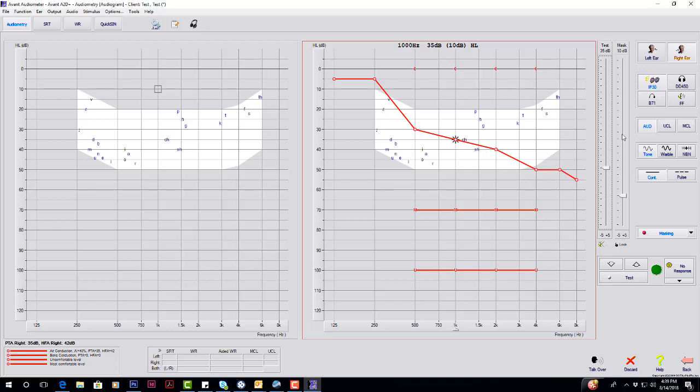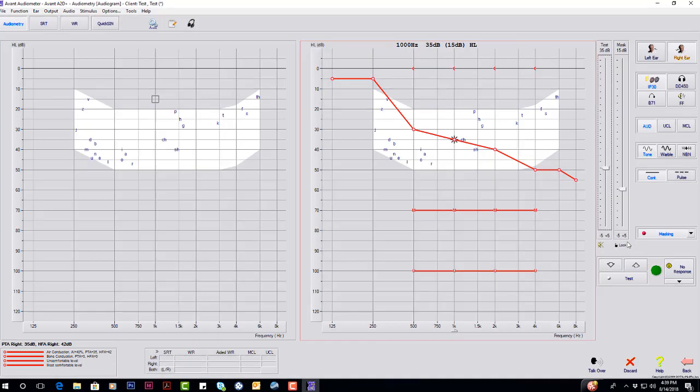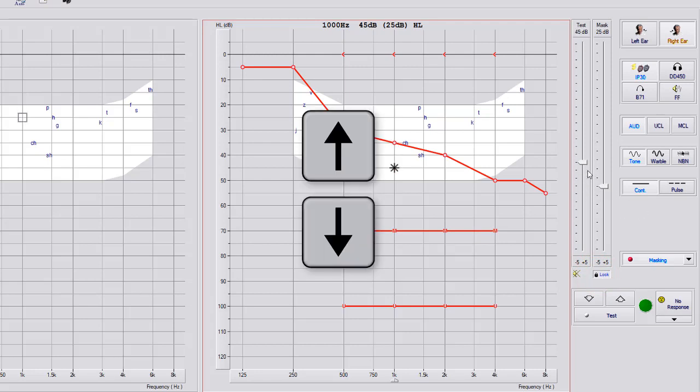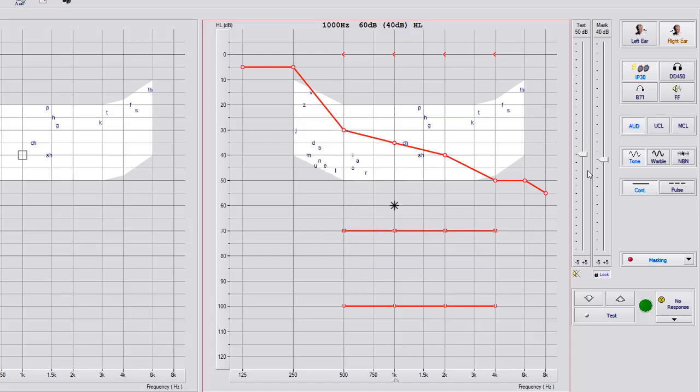One of the nice things about the masking portion is, if you've decided on the distance you want to keep between your test signal and mask signal, you can select this little lock button here. Now you can just use the up key, and it's going to keep that distance between the test signal and your masking signal.